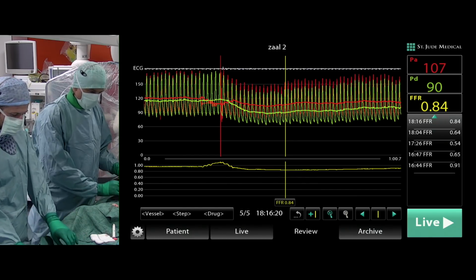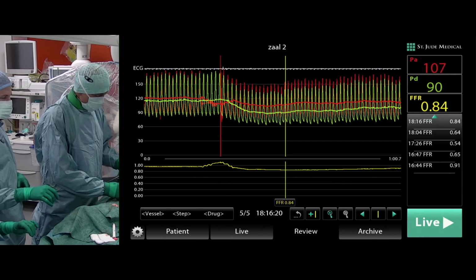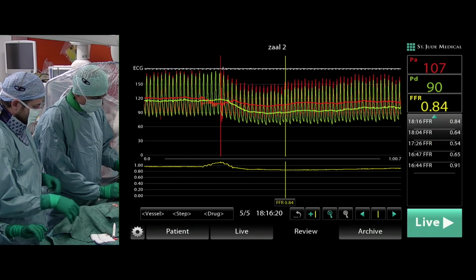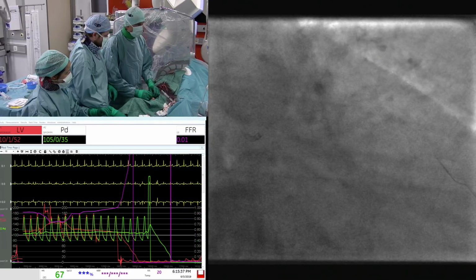Okay, OCT. So, in the interest of time, can you share with us what you intend to do now? OCT and stop, or do you still intend to do kissing or other things? No. Okay. If you agree, I would just do the final OCT, and it's important. This OCT is important because we are at the verge of the Illumin 4 trial, where really OCT will be used to guide stent implantation.